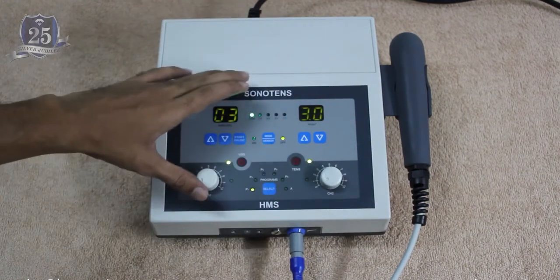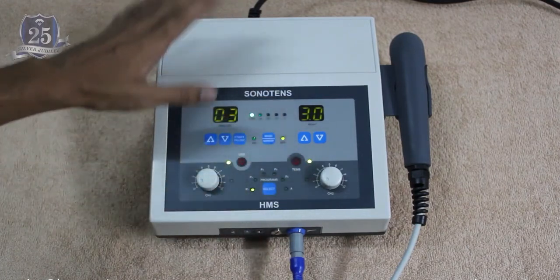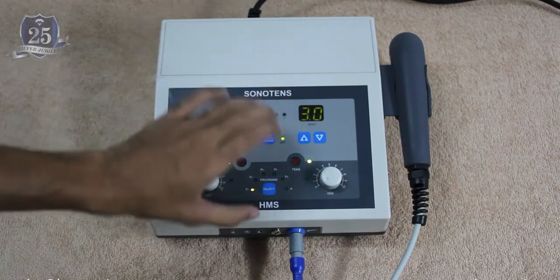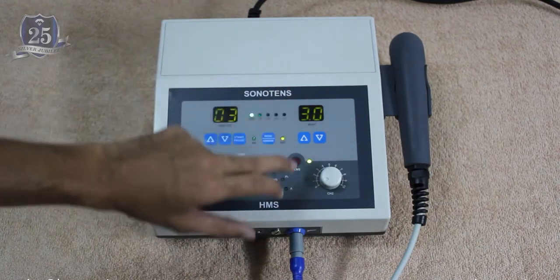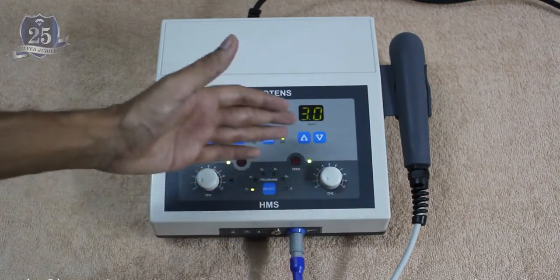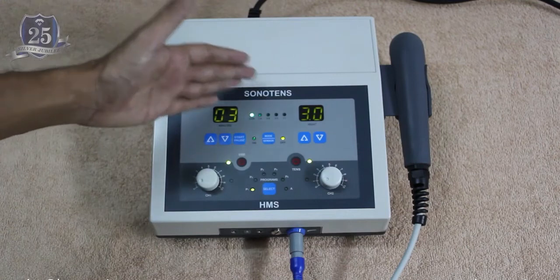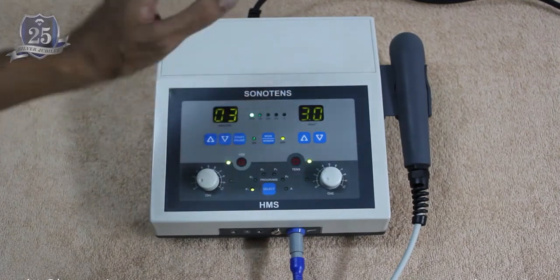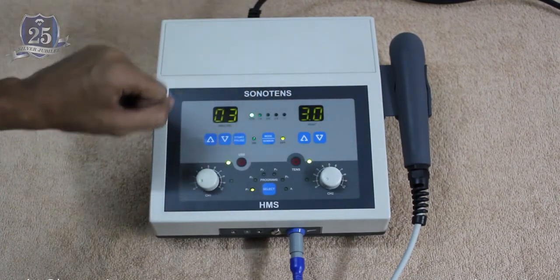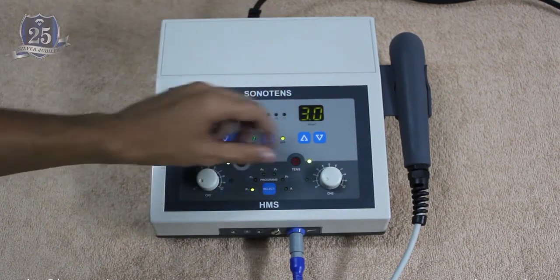So these are the basics to operate the TENS and ultrasound with this machine. And both the TENS and ultrasound can be operated with the combination therapy. So that is also available with this machine. That's the main purpose of this machine, having both the equipments within the same unit. So you can also have the combination advantage. So that's it with this machine.